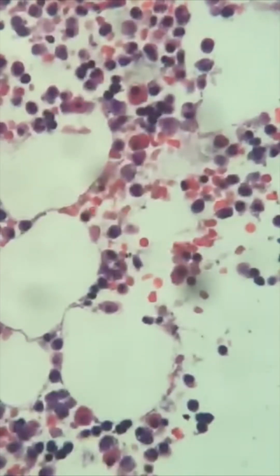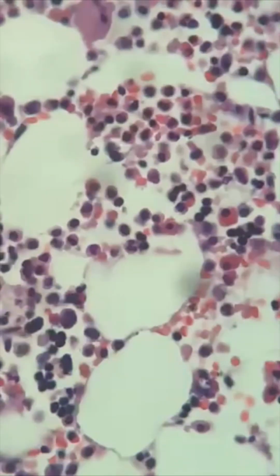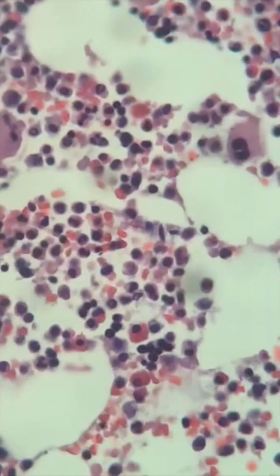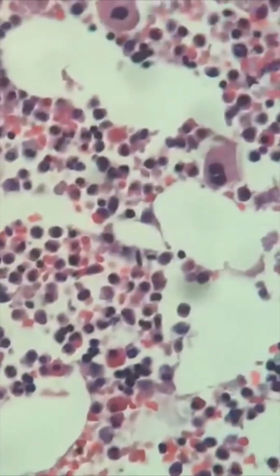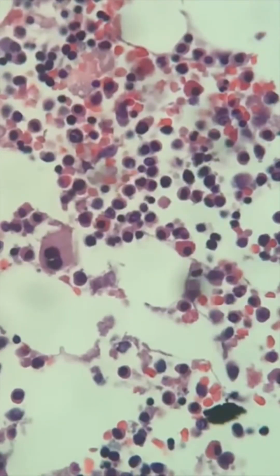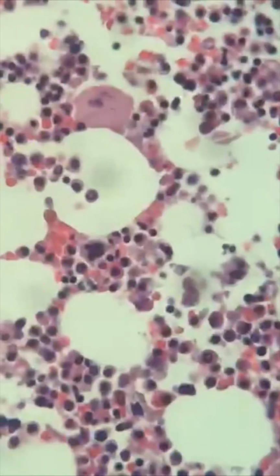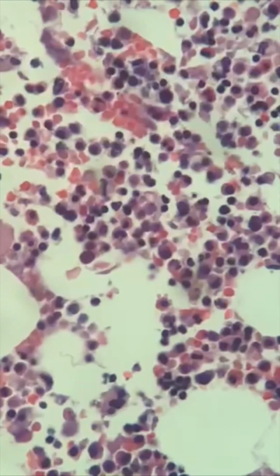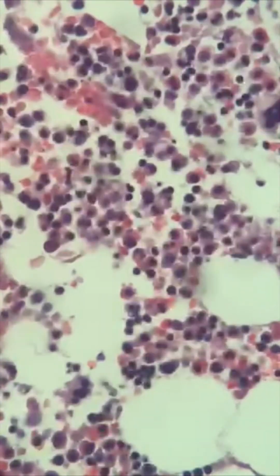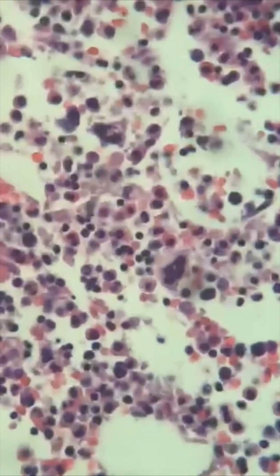Looking nice, eosinophils. These are maturing eosinophils. The ones that look orange are nicely formed eosinophil cells. Nice megakaryocytes. All normal in this person who simply died from an obstructed tracheotomy site that was bleeding and clotting, and lack of oxygenation. Just really unfortunate. A very acute death, as you don't even see that much erythroid hyperplasia, although I think there is some here. Obviously, before she died, it had to have been.